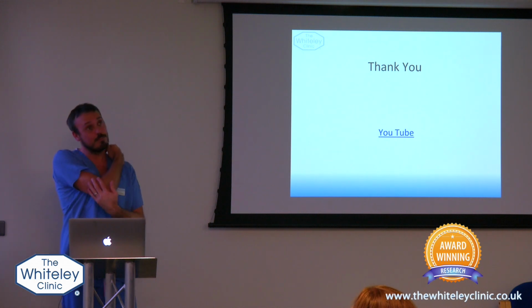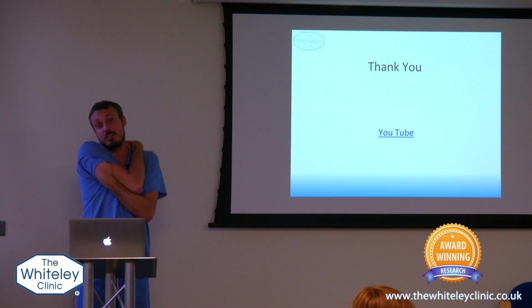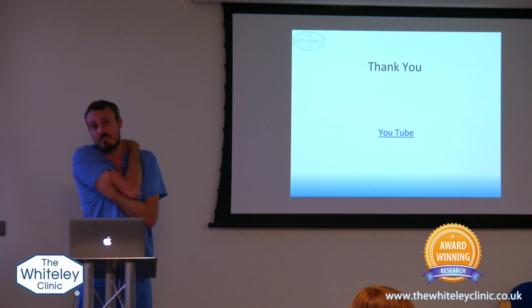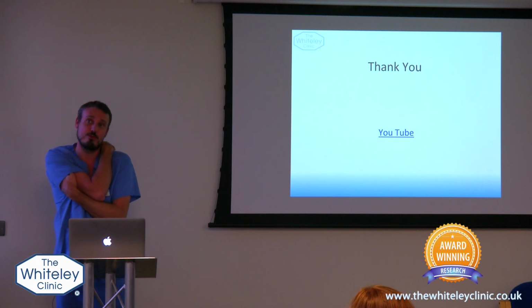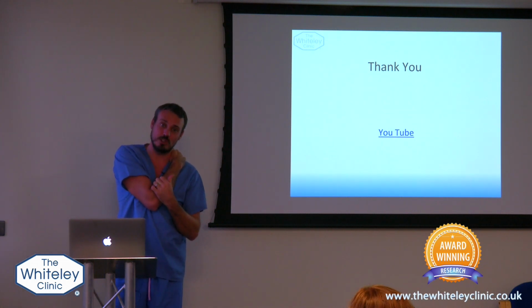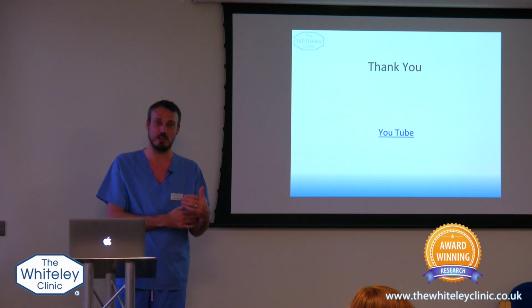And they said in about 1% of cases, the coil migrates. I've probably done somewhere between 300 to 500 of these now, and I've not had a coil migrate. I think that probably is because when that first person was producing his figures, he was producing his learning curve of the first 100 cases.